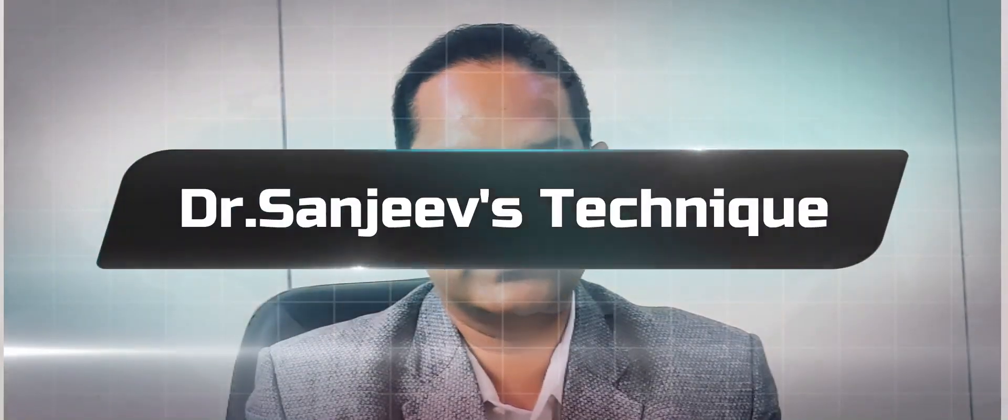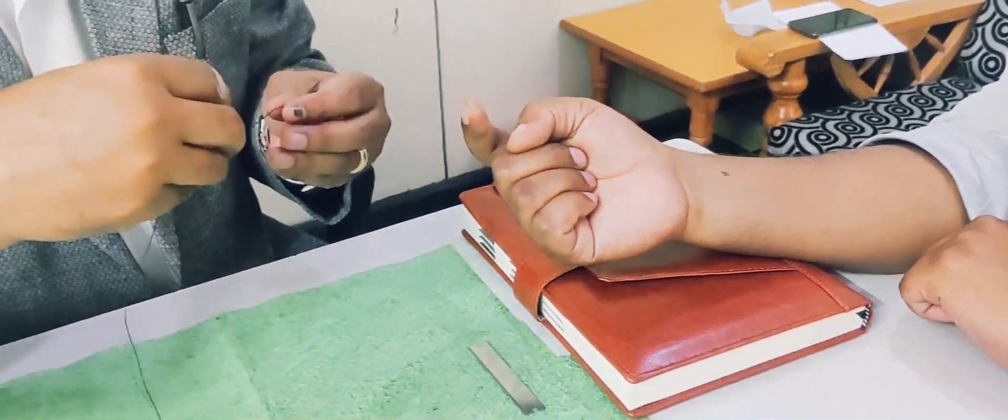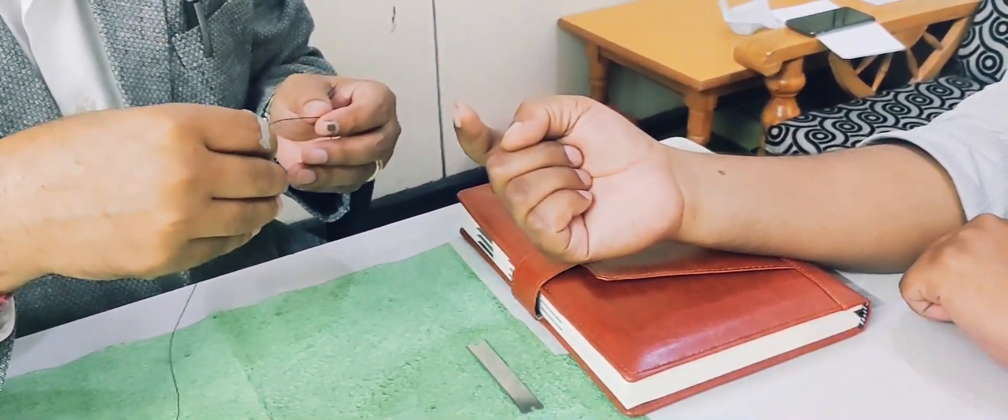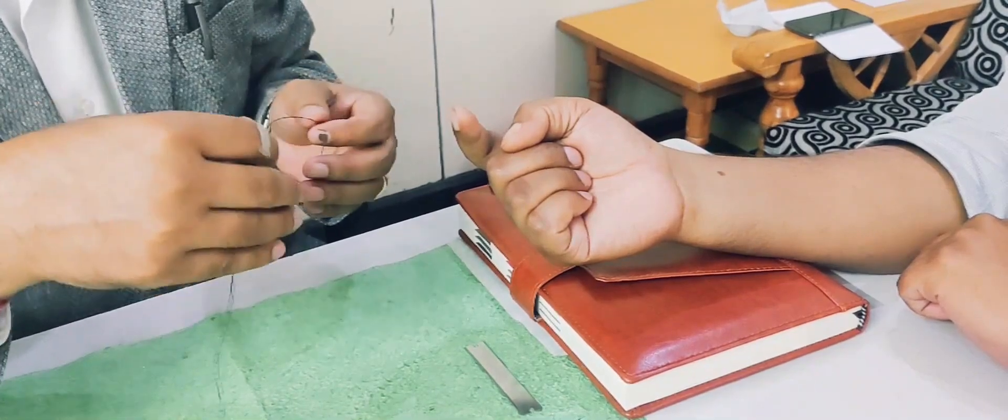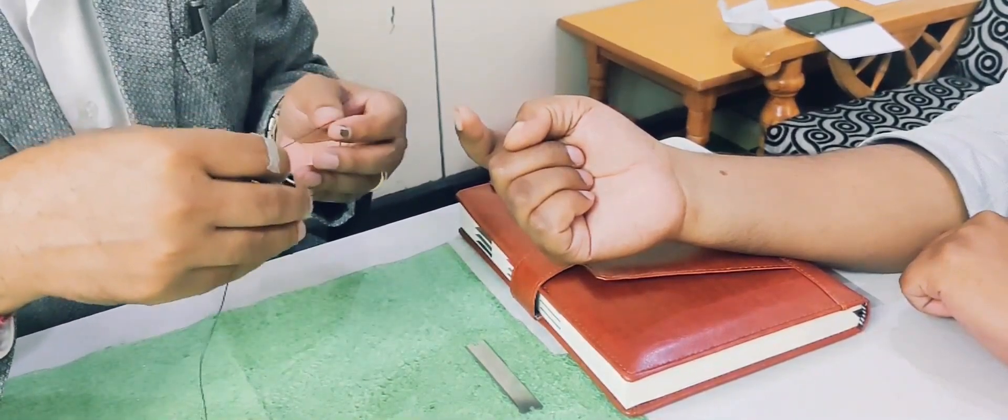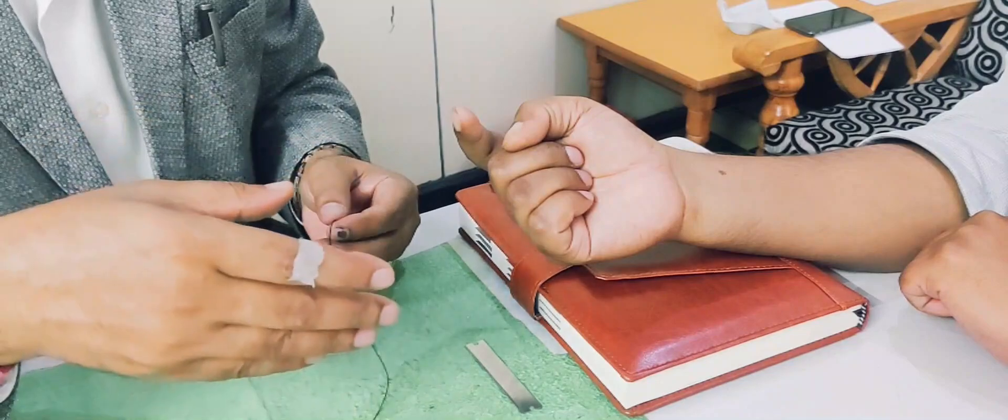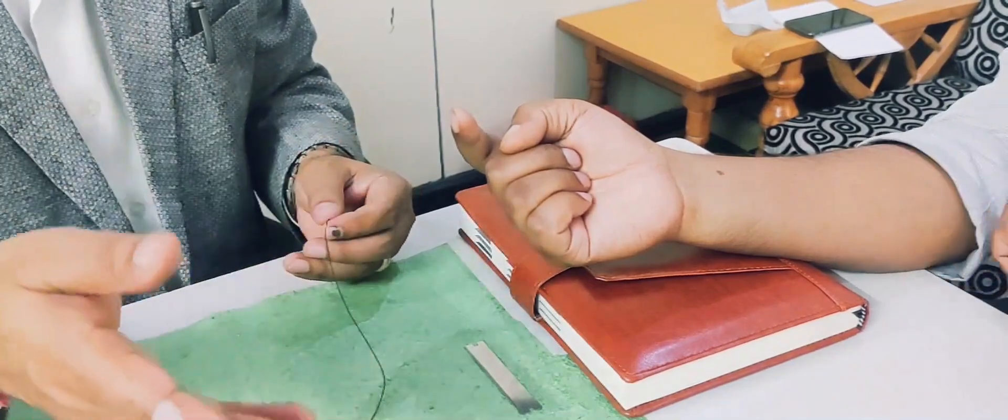The first technique is Dr. Sanjeev's technique which I will demonstrate to you firstly. You will ask your assistant to practice this kind of knot, and once you have practiced enough and you are confident that you can use this knot for your laparoscopic surgery, then you should apply this.